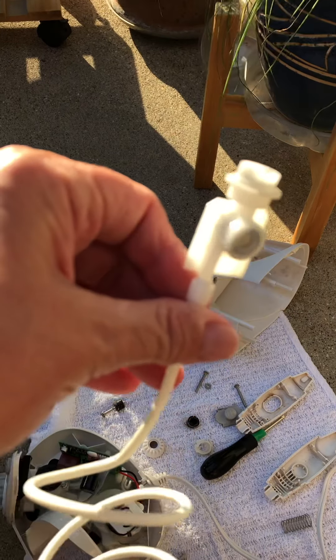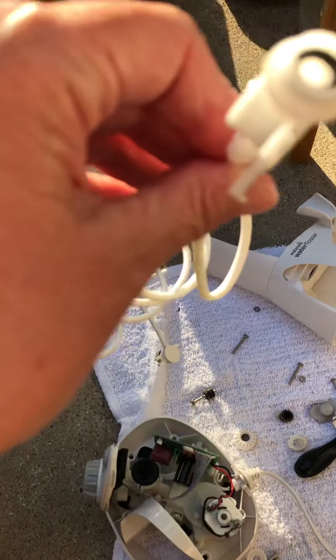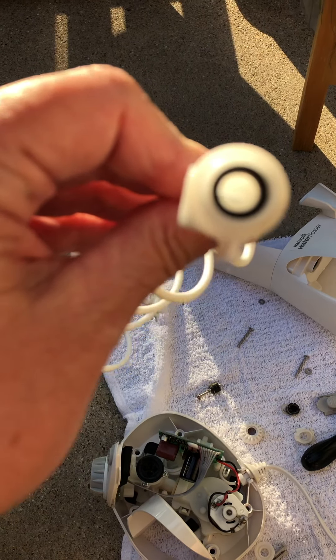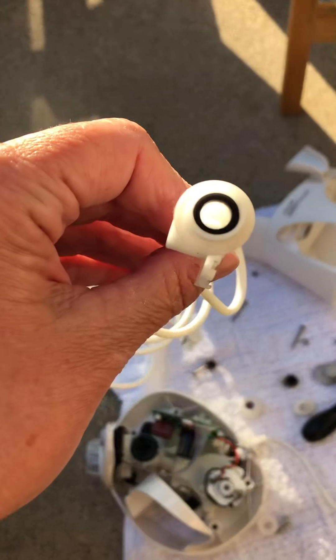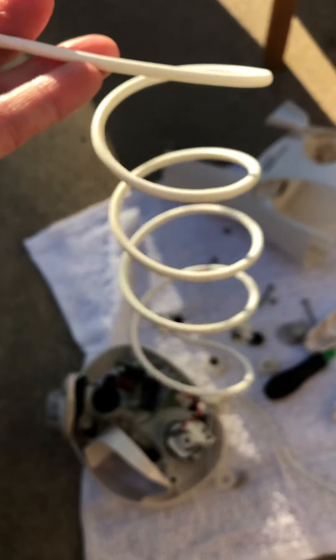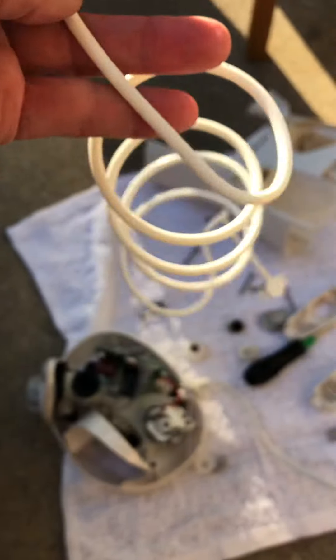I'm just curious if that's the case. I mean, I would prefer to have a handle. But if that little nozzle clicks in, I think I might keep this. I'll clean it with vinegar and keep it and see what I can use it for.